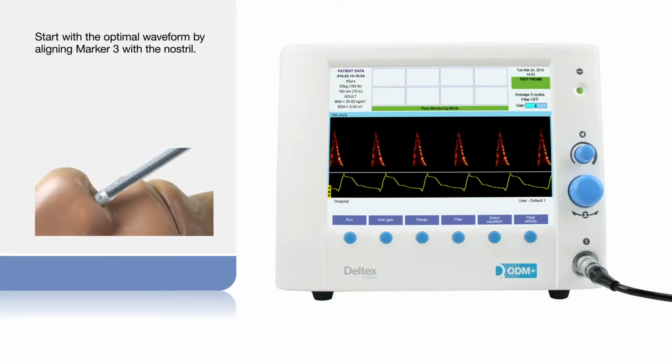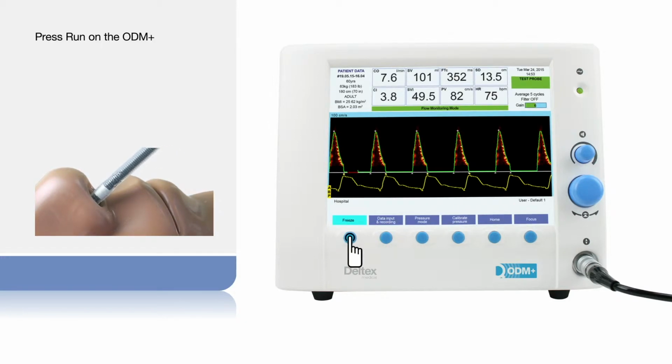Start with the optimal waveform by aligning marker 3 with the nostril. Press Run on the ODM+, and once the green line follower is in place, the flow parameters can be calculated.